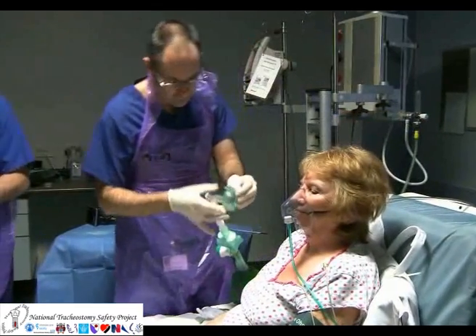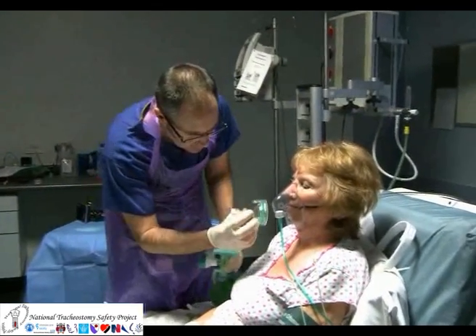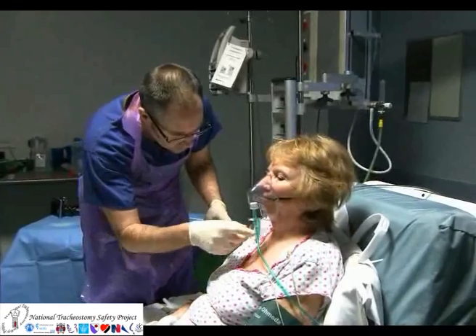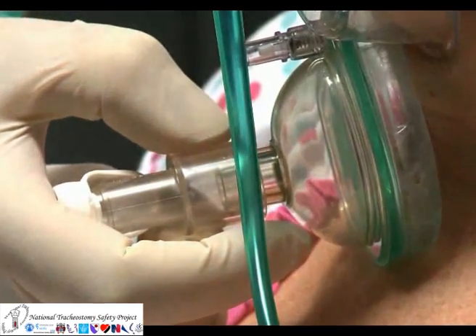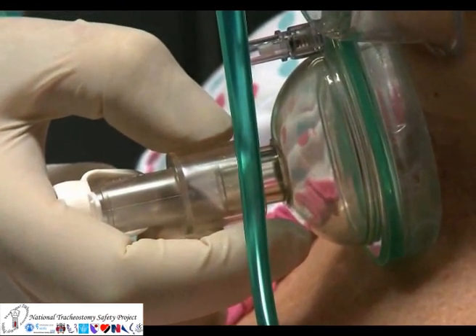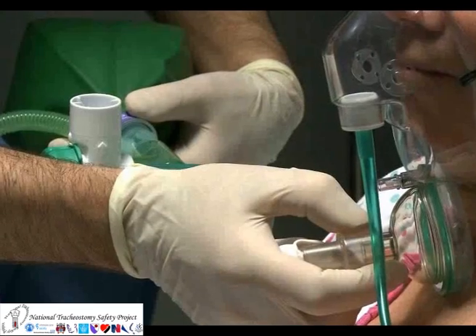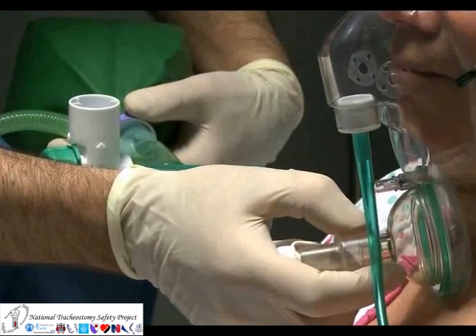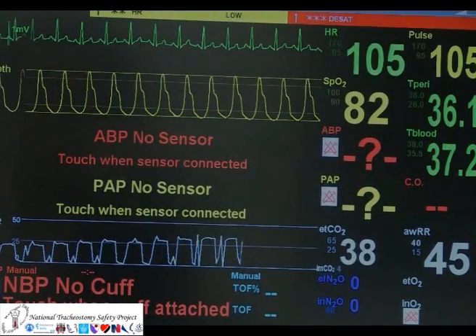A small or paediatric face mask can be applied to the stoma, or a laryngeal mask can be used. The Waters circuit provides additional clues to the adequacy of ventilation, and capnography should also be attached.